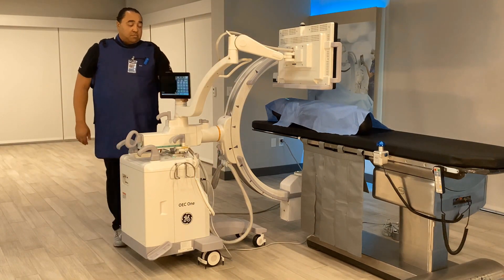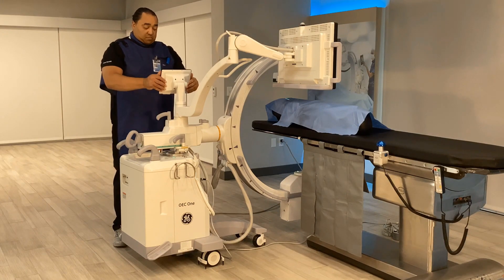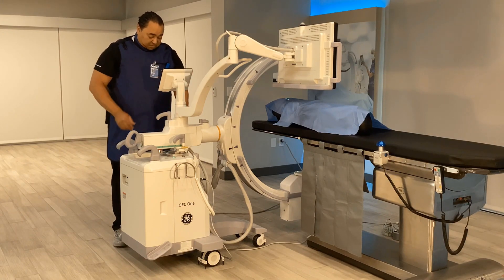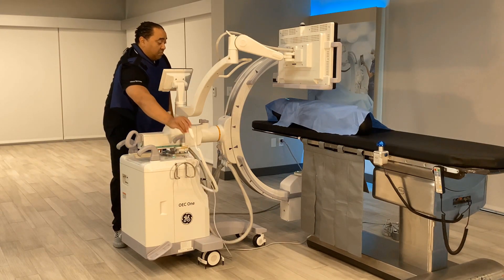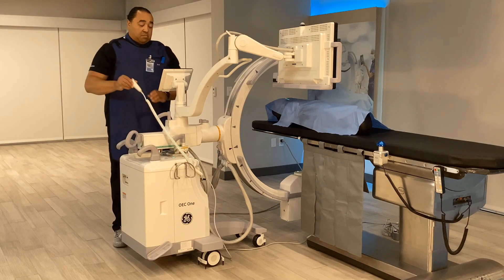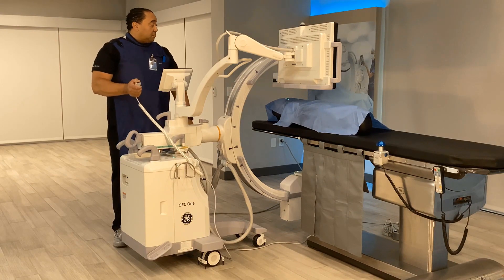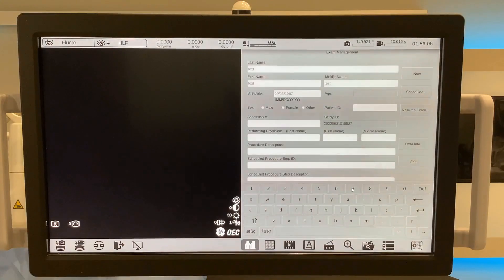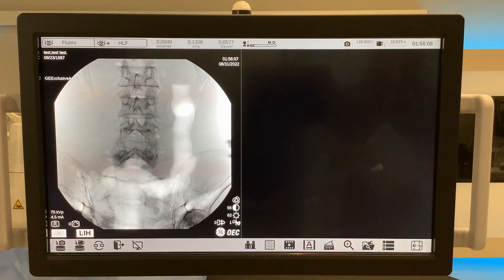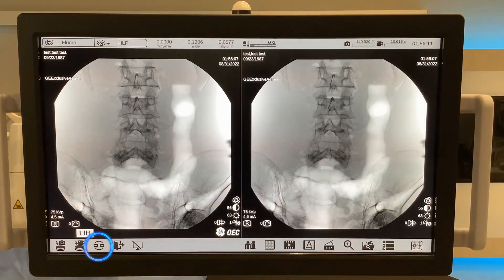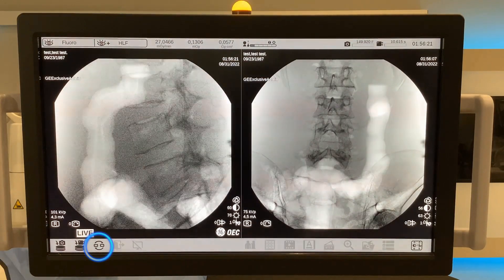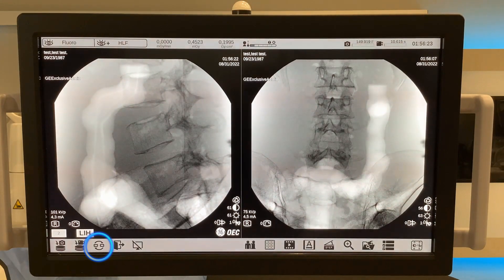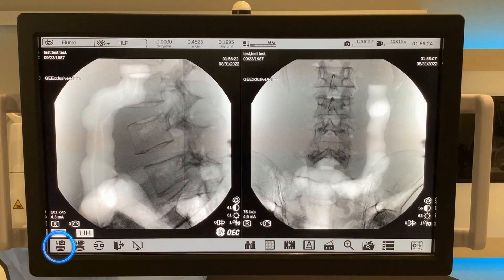Move the touch control panel for access during the case. Acquire the first image by utilizing either the hand switch or the foot switch. Live images will always appear on the left side of the monitor. Use the swap button to push over to the right side and create a reference image. Use the save button to save images into the image directory.